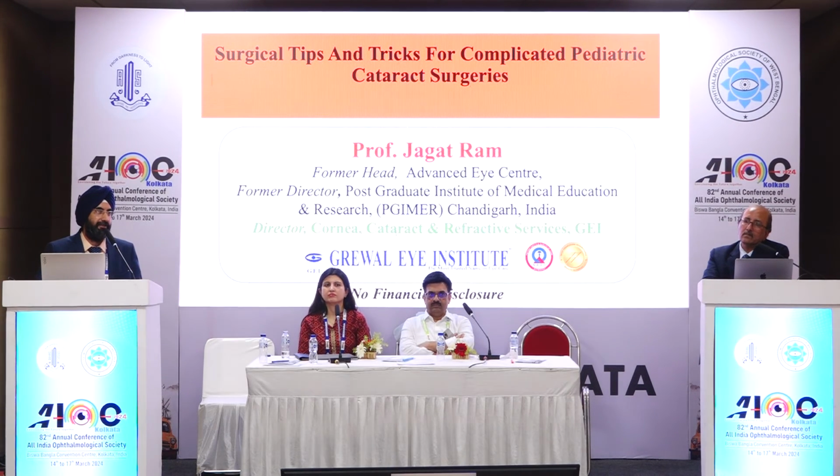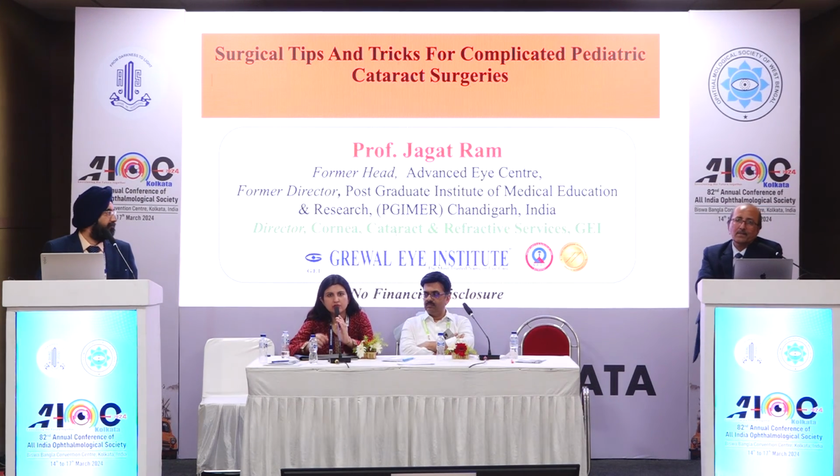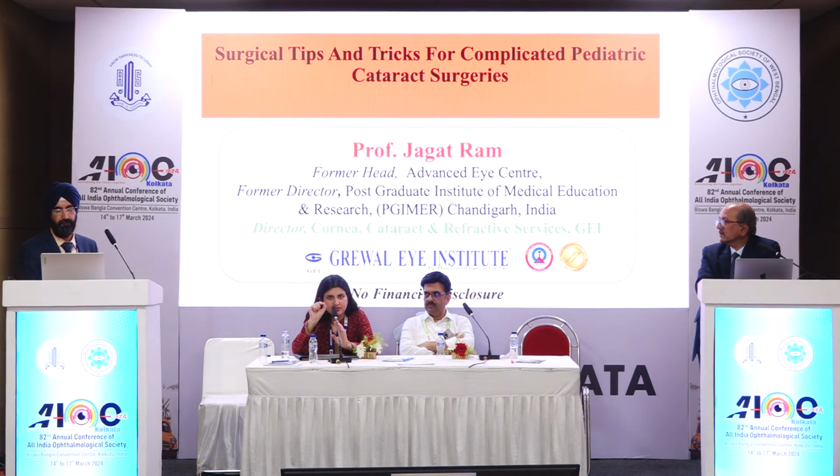And one more thing for the technique that you asked: you can just puncture the posterior capsule with a cystitome, put some cohesive viscoelastic in Berger's space to separate it from the anterior vitreous face, and then pull it around.